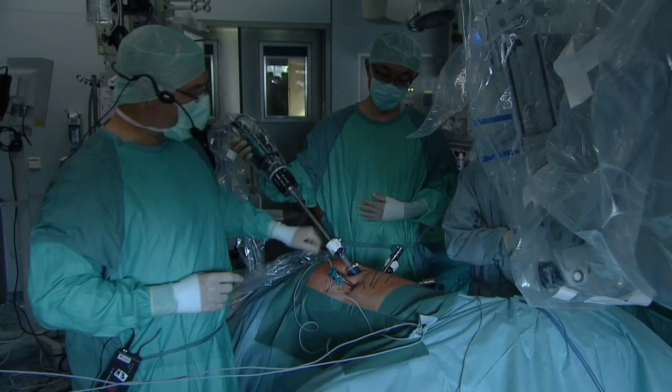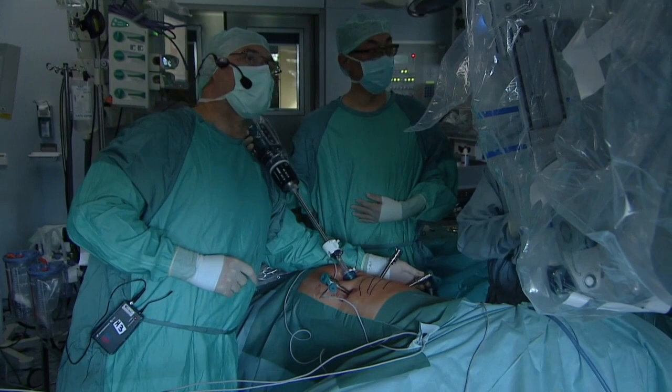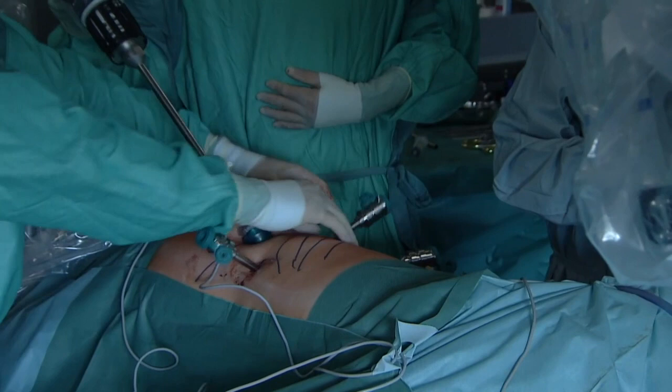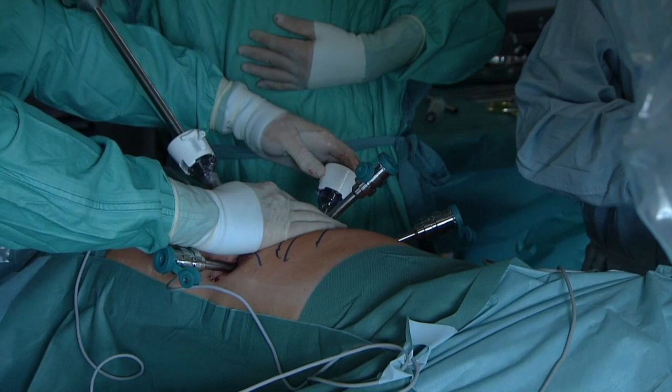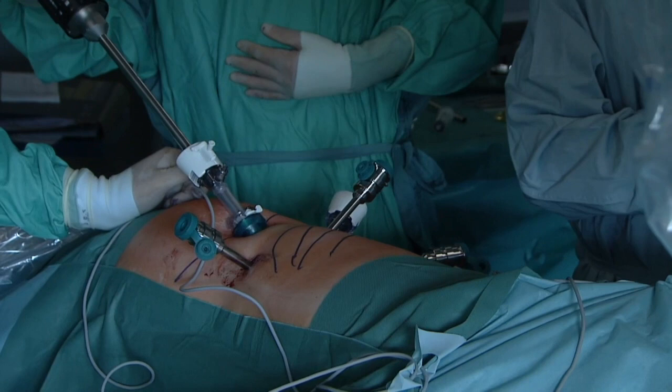This is going to be for my number two arm. And this will be for my number, we've got it backward here, number three arm here. So three arm, two arm, camera, and number one arm. My assistant port is 12 millimeter with insufflation, and it's near the anterior superior iliac spine. All these ports were placed under direct vision, and the peritoneum was pushed off anteriorly. So that's our port configuration, and now we're going to dock and start the case.